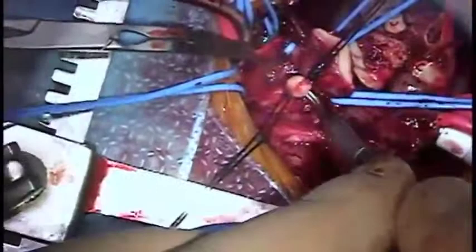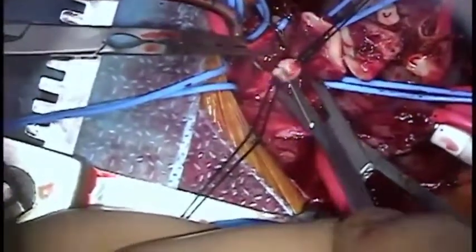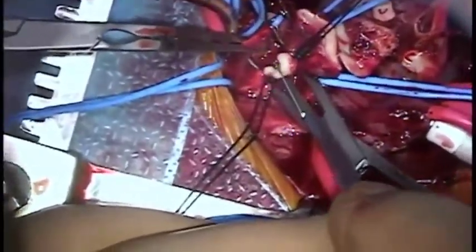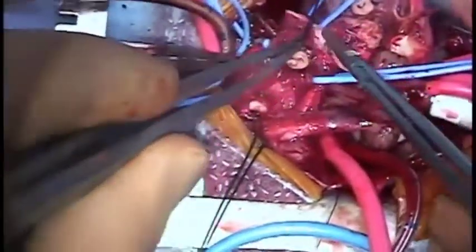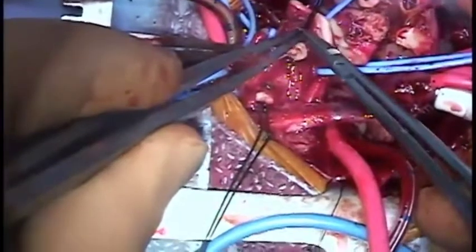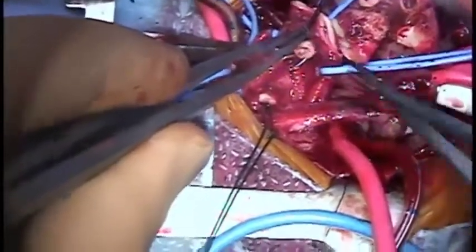The right-sided duct is now divided between ligatures. Cutting with a knife whilst the duct is stretched using a right-angle instrument allows a more precise division than when scissors are used. Note that a longer stump is left on the pulmonary arterial end as the aortic end will soon be excised. The pulmonary stump is oversewn as the ligature might roll off.